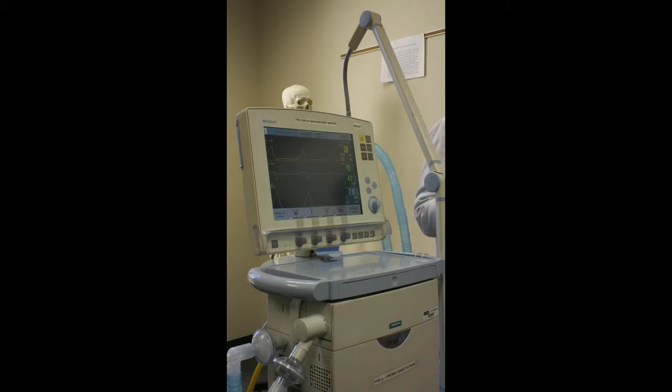And then spontaneous. Now this is the thing you're going to see done differently, depending on the RT and where you're at. Let's say we have a set rate of 12, and my patient's breathing 10. Our total rate is 22. Depending on the vent check sheet or the RT, some of them will say total rate, so that would be 22. Some say spontaneous rate.